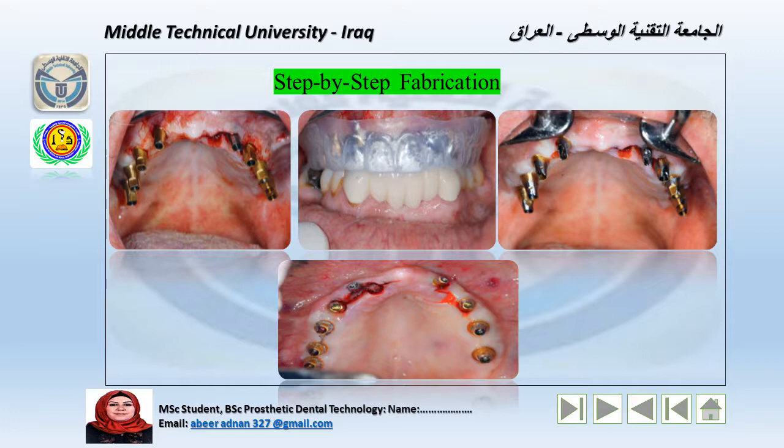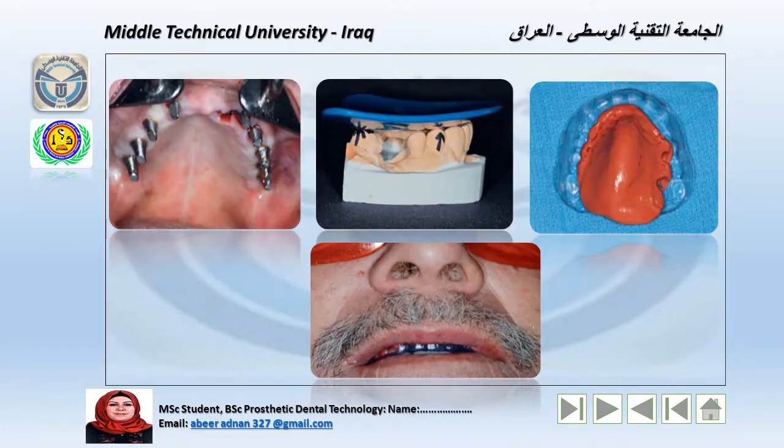The abutments are prepared in the mouth for parallelism with the high speed handpiece and carbide drills. وراح نستخدم الفوتوغراف mirror to evaluate the abutment parallelism. In the first figure, we notice the abutment screw holes are sealed with light-cure material to prevent the impression material from entering the hole of the abutment screw.